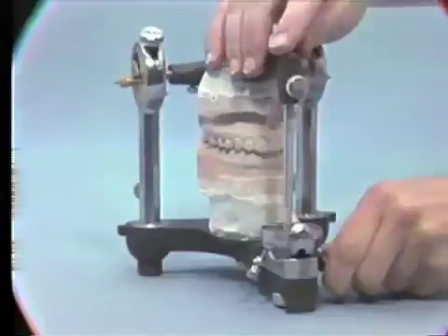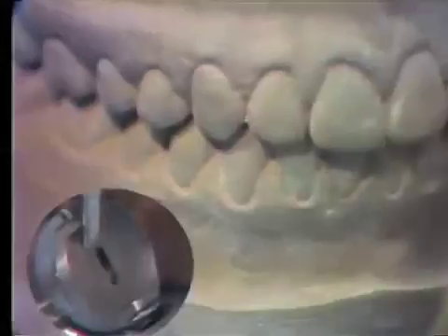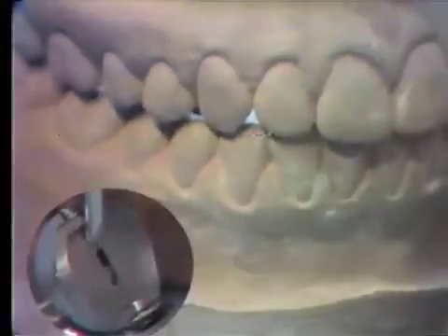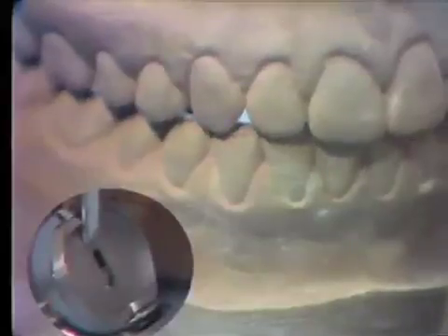If the incisal pin is centered distally and a positive inclination of the incisal table is required, the edge of the pin may contact the edge of the table before an adequate protrusive movement can be accomplished.